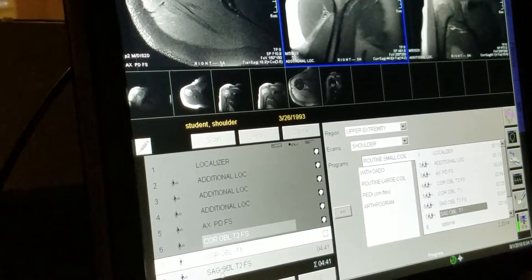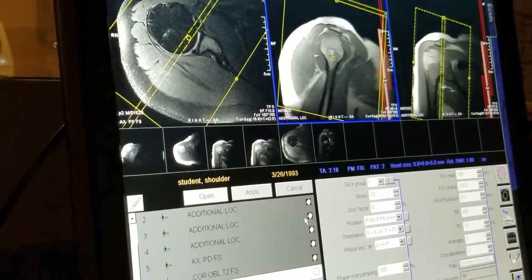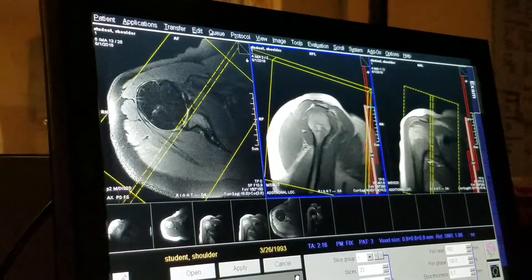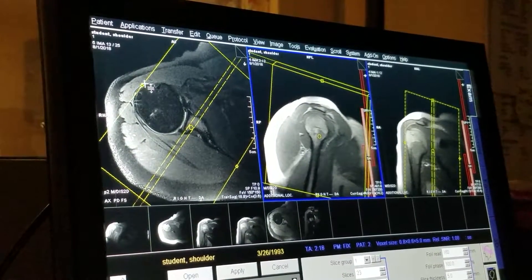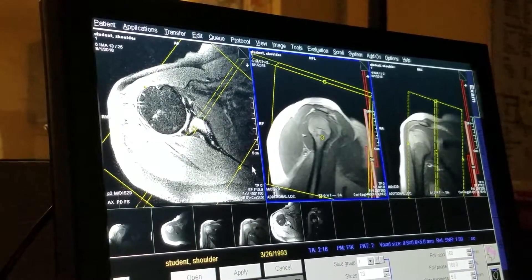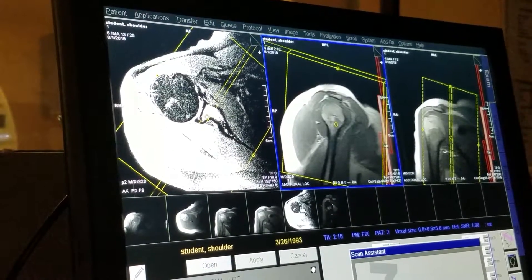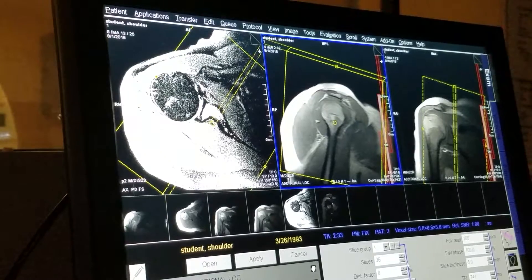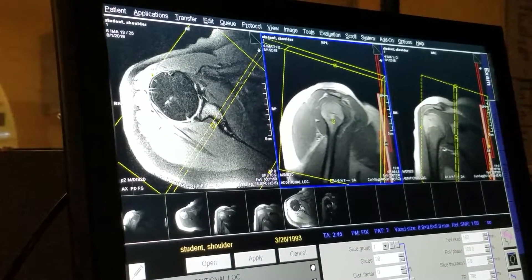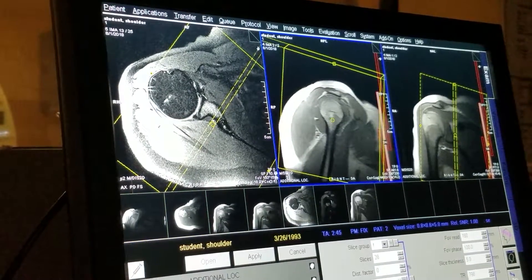Our sag oblique T1 — you can bring it over and now copy that to the sag oblique T2 simply for the angle. The purpose of this scan is to look at muscle atrophy around the shoulder girdle. So our most lateral slice, we can put right at the edge of the humerus, but we want to cover as medially of the scapula as we can. We're starting to lose signal here, so I'm not going to worry about covering any more medially. And then apply that.